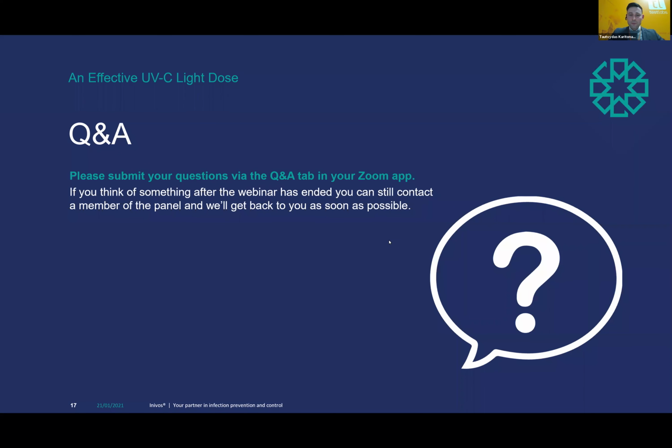Now, there's a question: how about equipment validation and certification? Can you share information about accepted standards and harmful doses for persons? UVC exposure to humans is well researched, and there are clearly safety limits, so when you use high intensity UVC light, you don't expect any humans to be present, exposed to direct UVC light. So the standards are there.